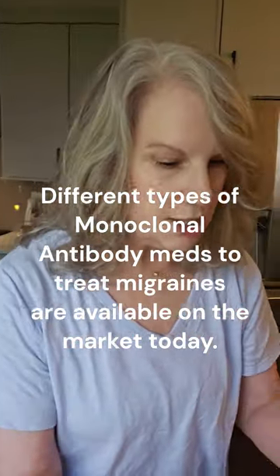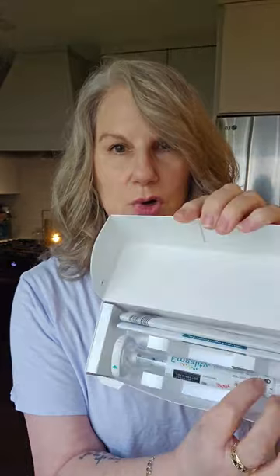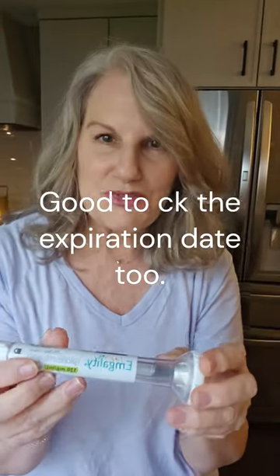So when you take it out, the box is going to look like this. Open it. You're going to take it out. You're going to make sure when you look at it that everything is sealed. Nothing is open. And make sure that it's your milligram dose that you want it to be. Your solution should be clear. It's always good just to check the milligram dose because, you know, mistakes can happen at the pharmacy.